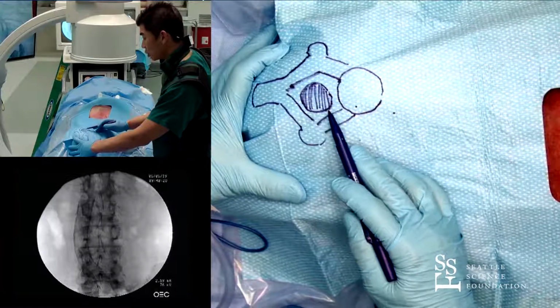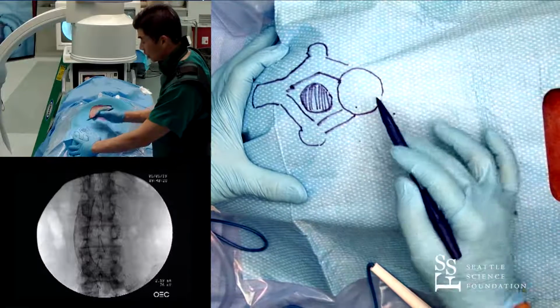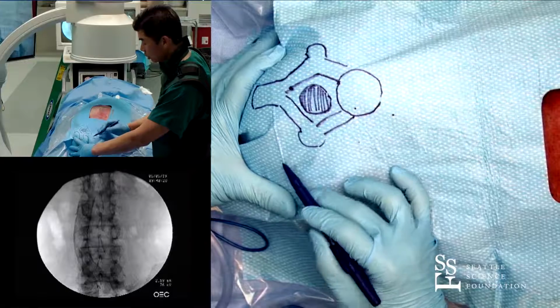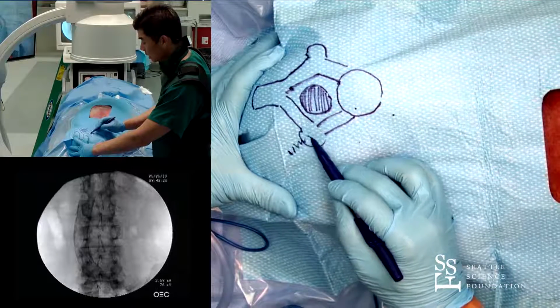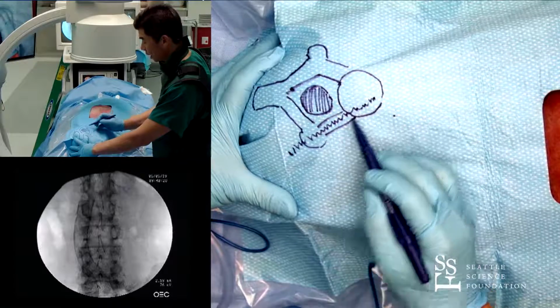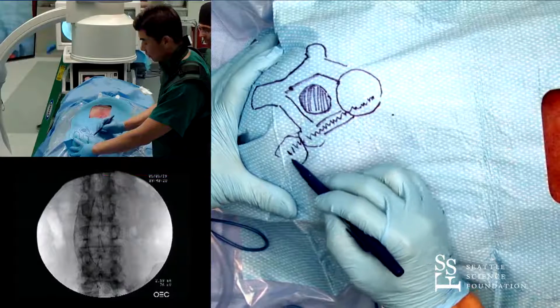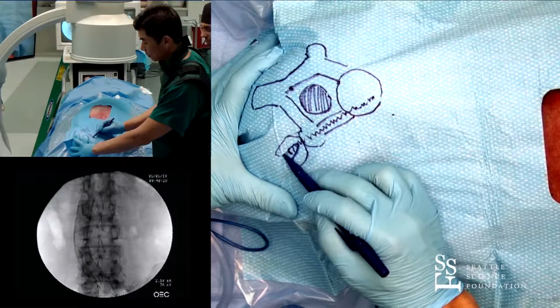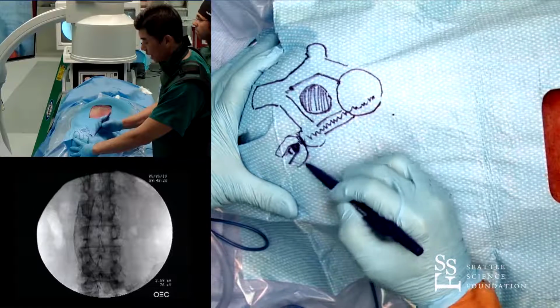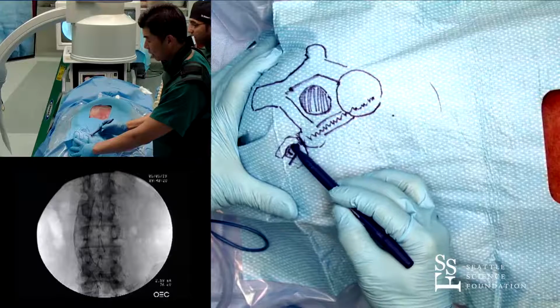So when we put in screws, we wanna get fixation, especially if we're doing scoliosis corrections. We need to grab this vertebral body. So the idea is that we're gonna put a screw like this, right in this narrow piece of bone called the pedicle. And then the screw has a little bit of a fastener, a slot, and this head can move. So it's a polyaxial screw. The head can move on the screw, and then we're gonna place a rod right there.